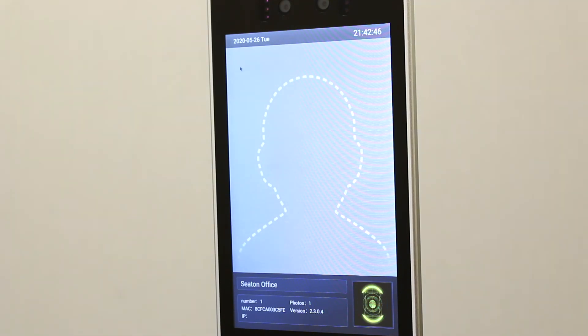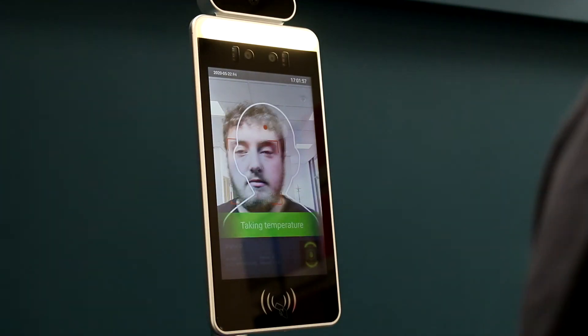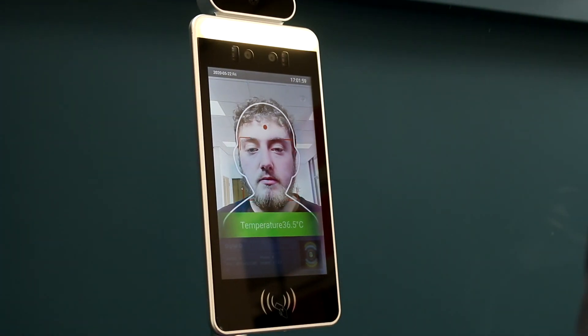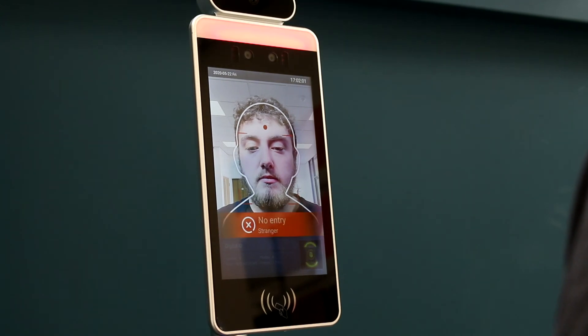Step seven, when a stranger approaches the kiosk for screening, the temperature check will take place and an alert will sound that no admittance is allowed.